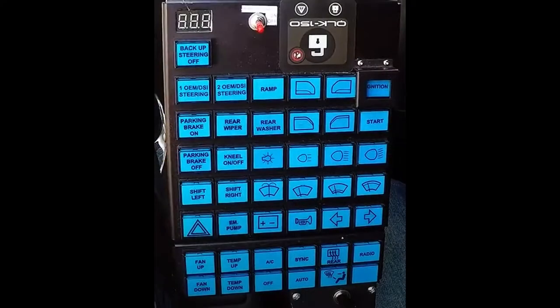What you see here is my secondary controls. This allows me to shift gears, open and close windows, control the radio, and do everything.